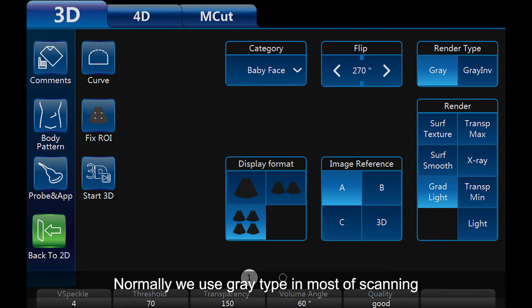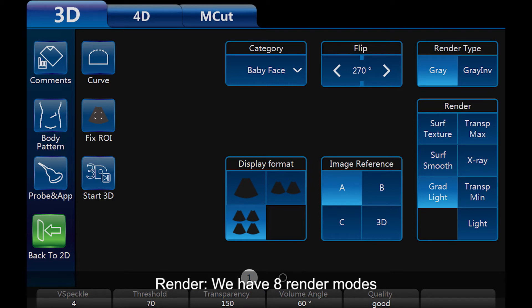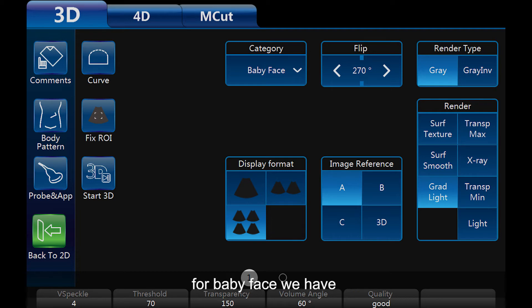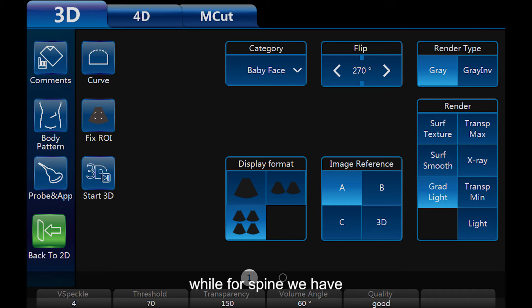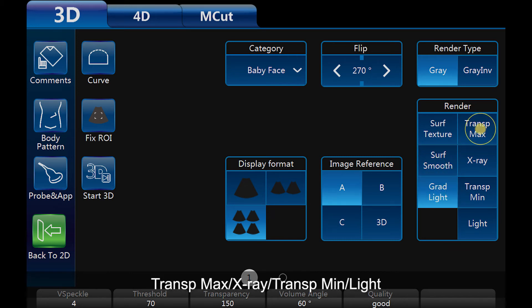Normally, we use grey type in most scanning. Render: we have 8 render modes. For baby face, we have surf texture, surf smooth, grad light, and hq surface. For spine, we have transparency max, x-ray, transparency minimum, and light.